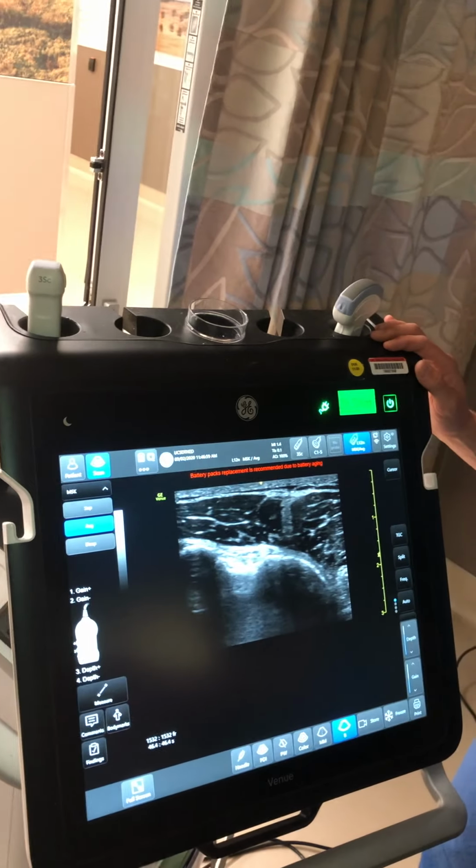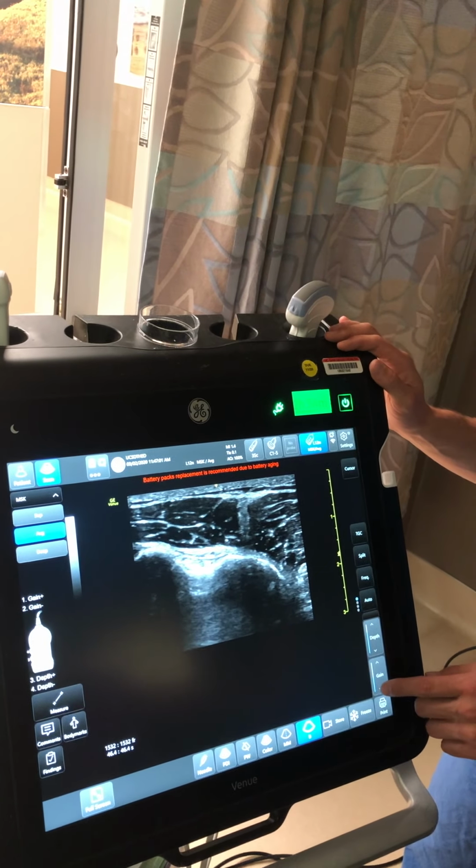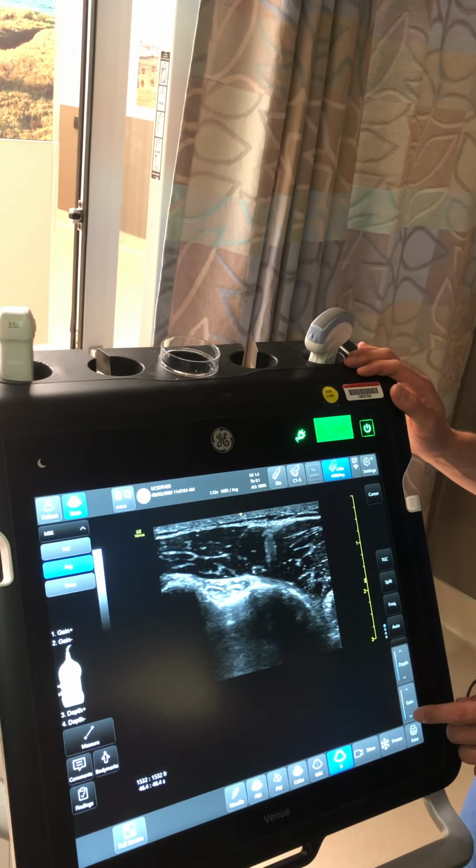Okay, Dr. Cole, would you mind decreasing the gain a little bit? It comes across as a little hyperechoic on the video, but yeah, thanks.